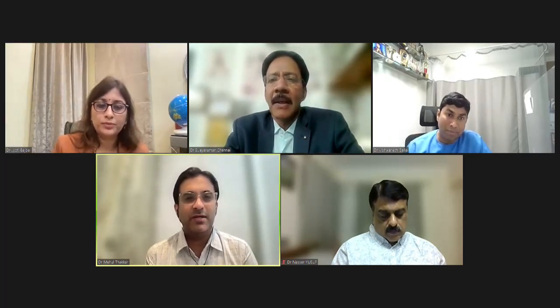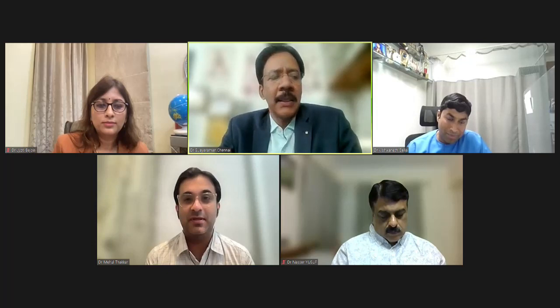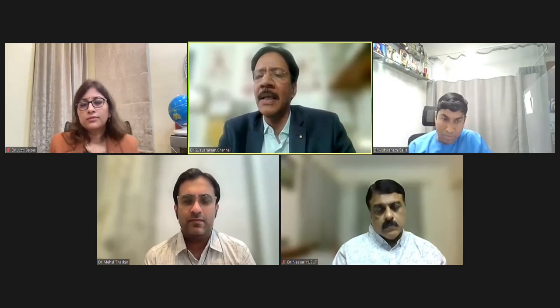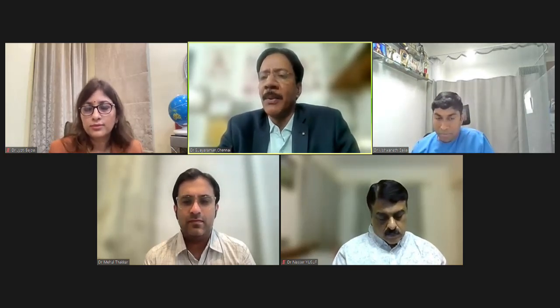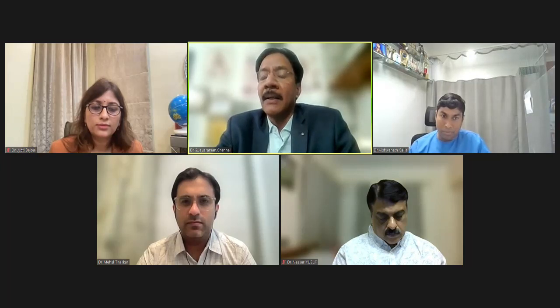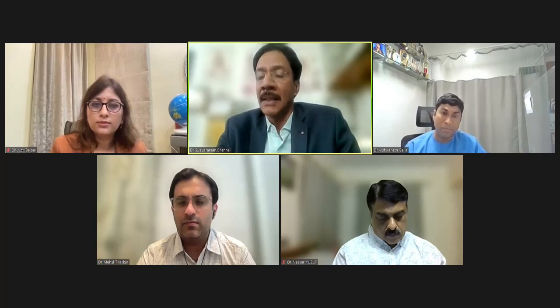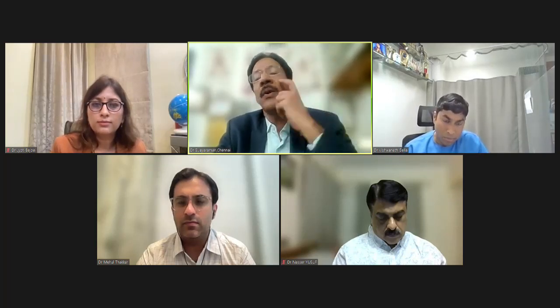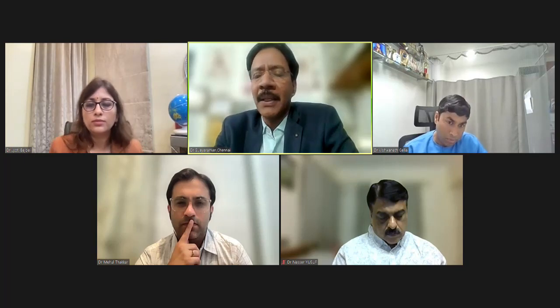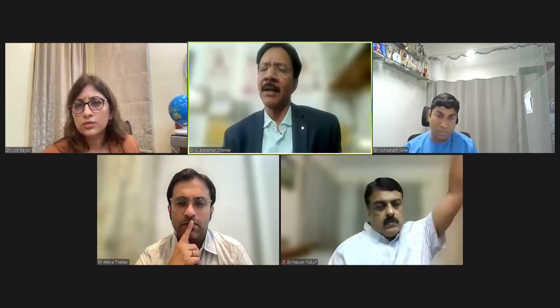Dr. Jeremy, do you have any other data, like what is the current data on cryo? Because that is the most common question asked in the chat box. Yeah. See, the role of cryobiopsy, if you deal with a malignant pleural effusion, there is a malignancy, needs more tissue, obviously. In the case of malignant pleural effusion or primary malignancy, mesothelioma, or the secondary metastatic from the lung or the breast or nearby organ, the larger chunk of tissue will help in the molecular diagnosis and other immunogenetic diagnosis, very useful for the targeted therapy for the oncologist. This is a very important thing for the cryopleural biopsy. Otherwise, if you practice the rigid thoracoscope and rigid forceps biopsy, as Madam already mentioned, this is superior.